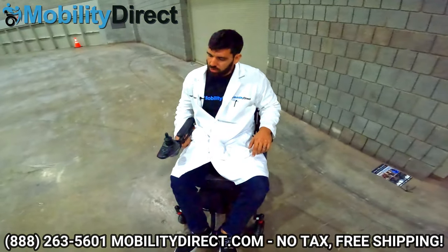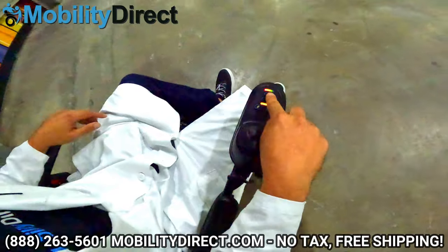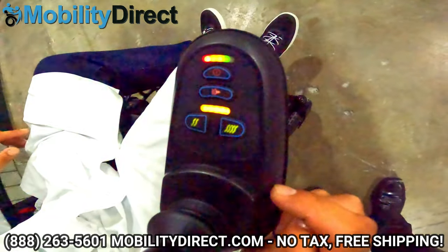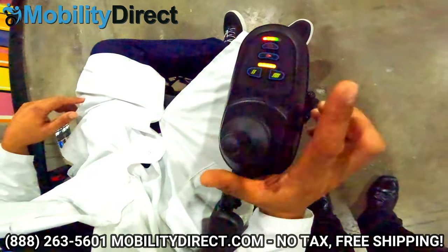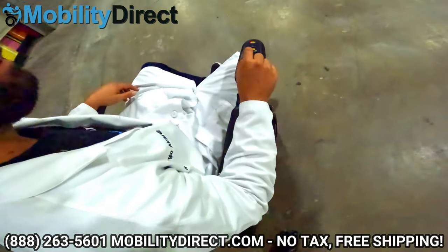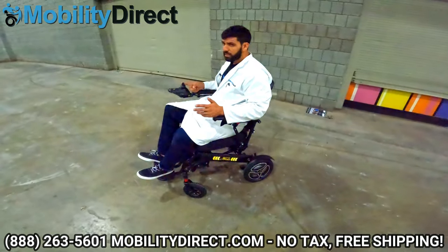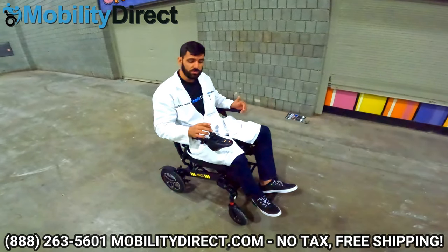Let me show you how to operate the joystick. There's a power button, and once you turn it on you'll see the battery LED lights — you never want to get it all the way to the red. Right now it's almost at a full charge with one green light missing. Here's the horn button, and these buttons control the speed modes — right now I've got it in the slowest setting; the highest speed setting goes just under five miles per hour. Just like any power wheelchair, push the joystick forward to go forward, pull it back to go back. Push right and it rotates clockwise; push left and it rotates counterclockwise. It takes a little getting used to, but it works like any other power wheelchair joystick.